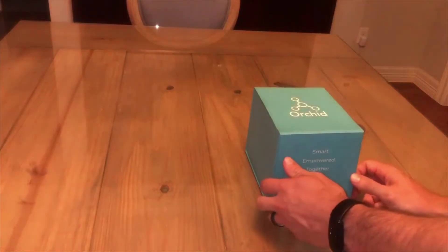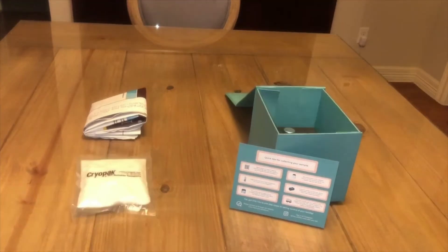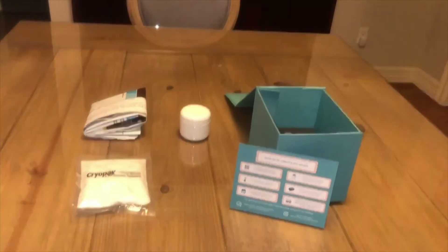When you open your kit you will find a card with quick tips, a shipping bag with a prepaid label, a temperature control pack, a collection cup, and a vial of preservative.